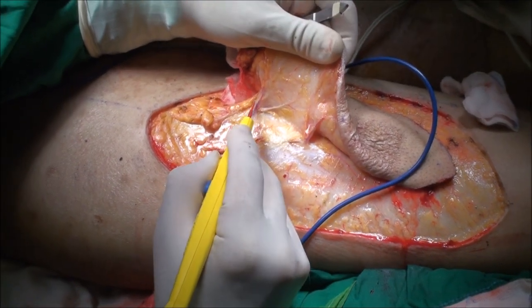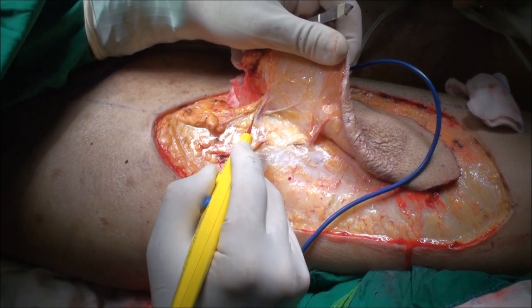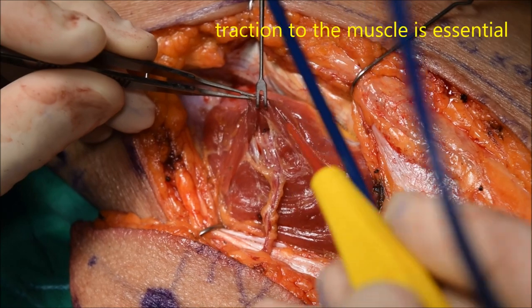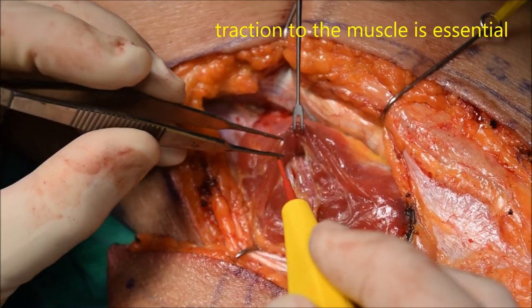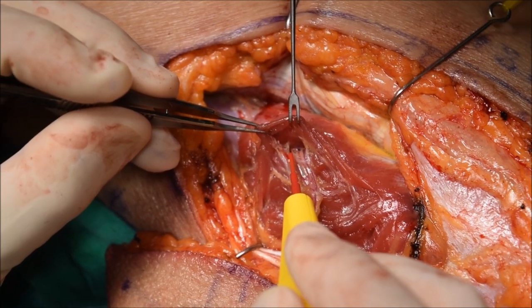Now once you have identified the perforator, you split through the deep fascia. One great thing about using this monopolar cutting mode is that you don't have to transition back and forth with a bipolar and a monopolar, and you don't have to grab your scissors — so this really saves a lot of time.